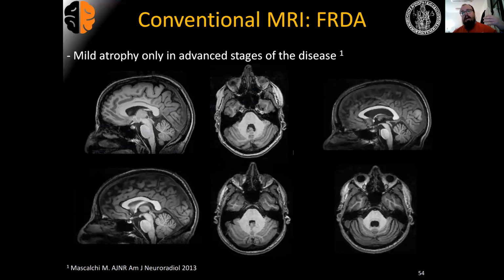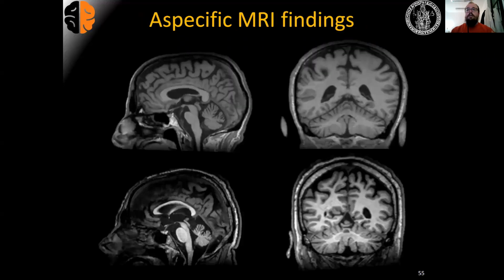It happens to have the presence of cerebellar atrophy with some medulla oblongata atrophy in a very last part of the disease, when it becomes very much manifest. But in most of the phases of the disease, the cerebellum looks normal in Friedreich ataxia. Unfortunately, you don't usually work with these cases.